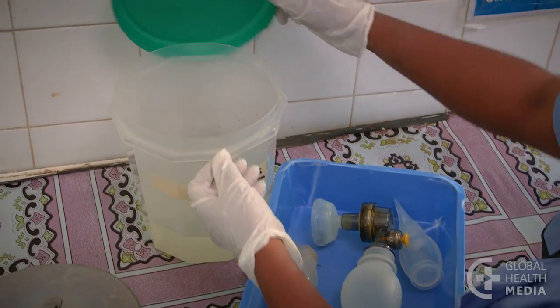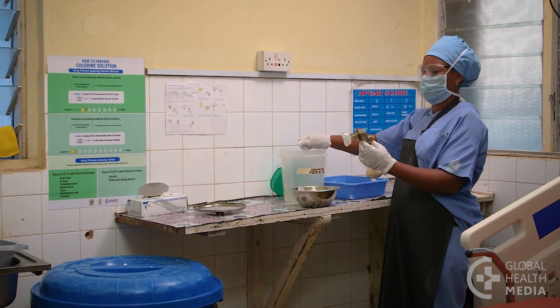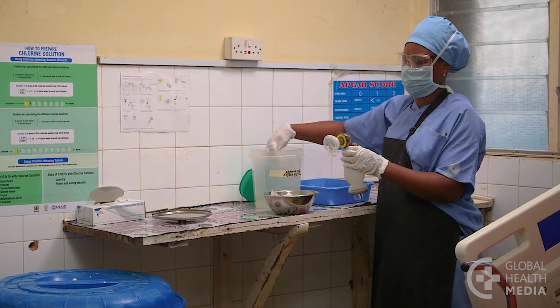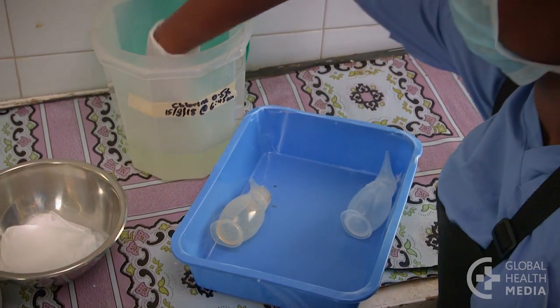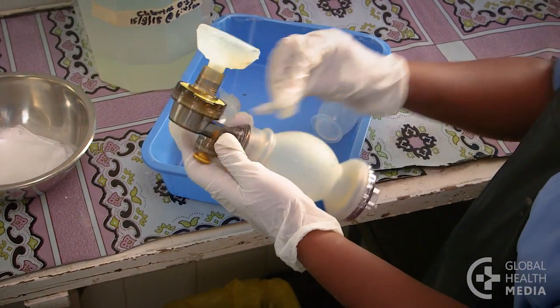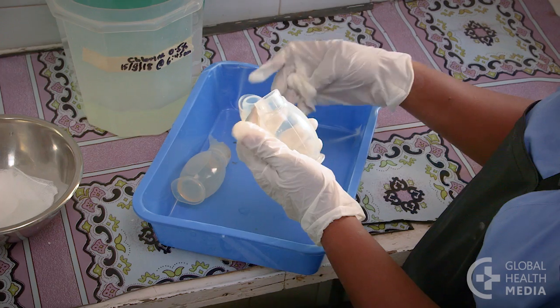Next, wipe off the equipment right after use. This step makes cleaning easier and safer by removing secretions before they harden on the equipment and removing harmful germs such as hepatitis or HIV. Dip a piece of gauze in your solution of chlorine and wipe all the surfaces on the outside of the equipment. Re-soak the gauze when you start on a different piece.